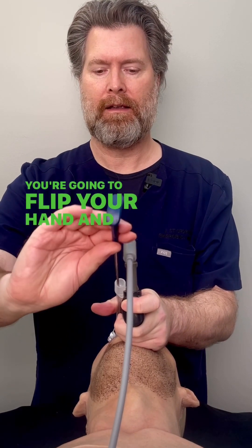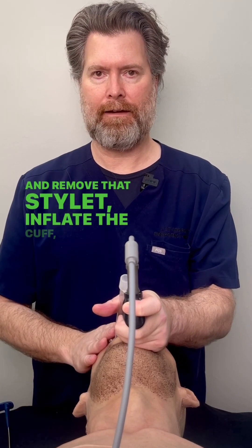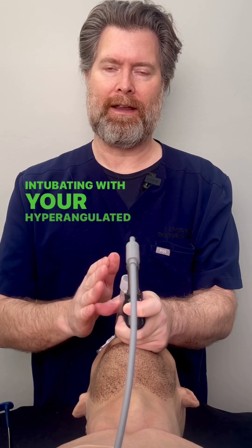You're going to flip your hand and go ahead and remove that stylet, inflate the cuff, and you've finished intubating with your hyper-angulated blade and your rigid stylet. Well done.